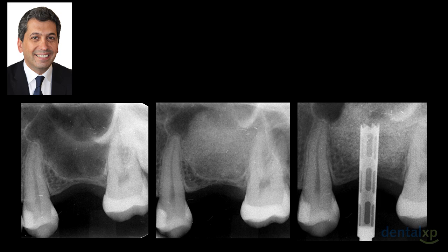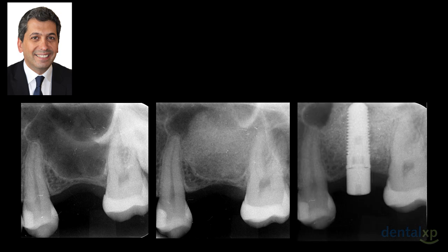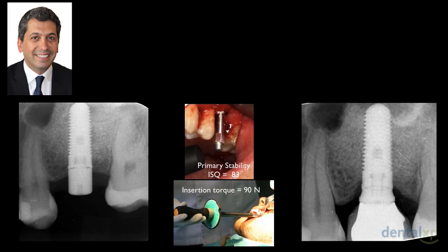As a clinician, before going into the details of histologies or the behavior of biomaterial, whenever we need to graft a sinus like this one, where we have a very low residual ridge of 1 millimeter, we fill our sinus, and we come back 6 months later to drill into the sinus and place our implant. What interests us is to have a bone that is hard, that is similar to natural bone, where we can place our implant predictably and without having any problems.